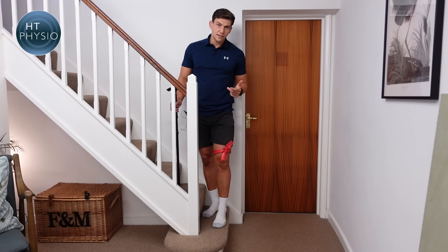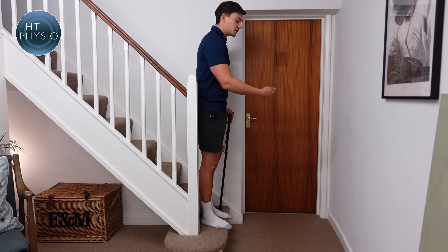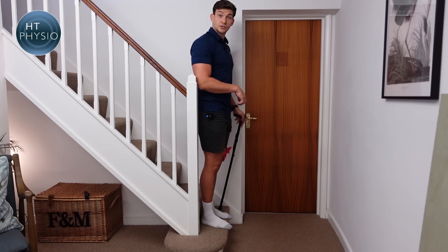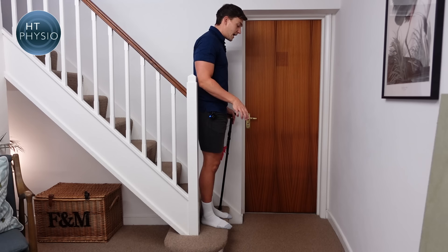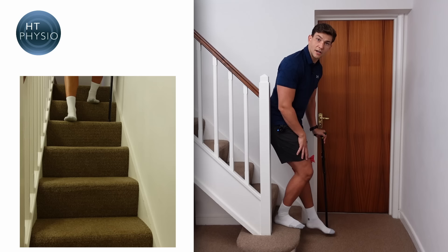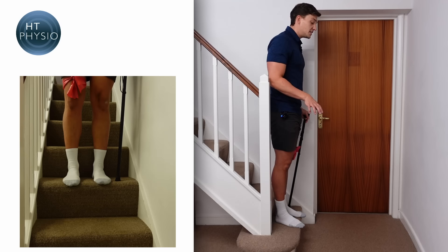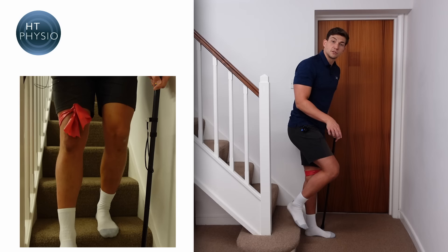Now how do we come back down? Remember 'the good go to heaven, but the bad go to hell' — the bad leg is the first one down. Holding the handrail, we first put the stick down, and then the bad leg comes down to meet it. The reason we do it this way is because the strong leg is actually doing most of the work — even though it looks like the bad leg is leading, it's the strong leg that's working harder. To descend: use the rail, put the stick down, bad leg comes down to meet it, then the good leg comes down.